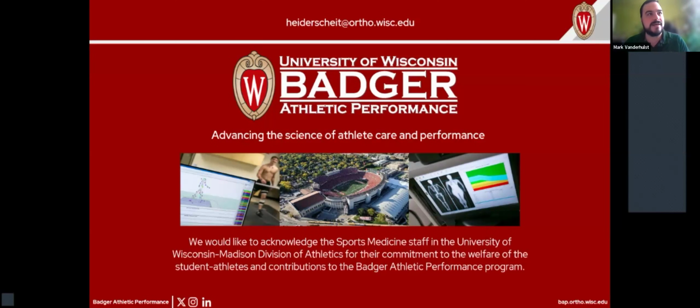So just to kick us off, could we see this applied to other ligaments like the deltoid, for example? Yeah, that's a great question. I think the key to being able to utilize this for other ligaments is, one, to keep the probe positioned fairly stable throughout the test. And then two, to have a good physical exam test that works well to stress that ligament.